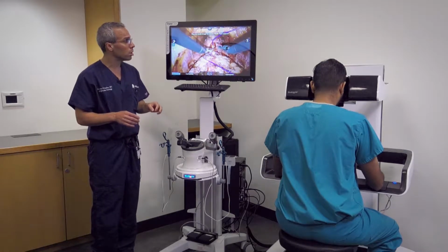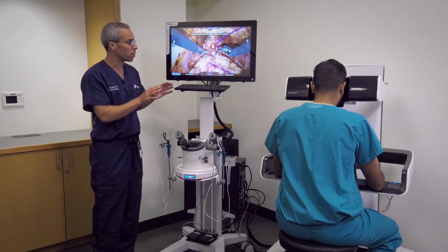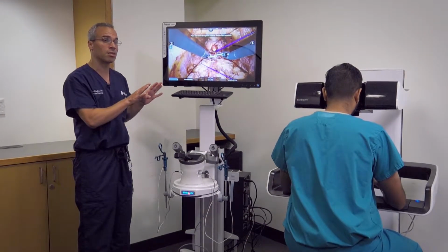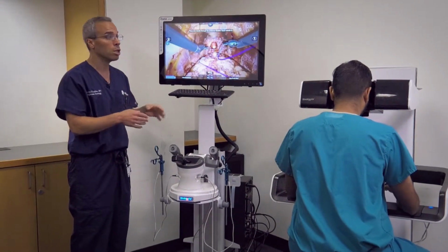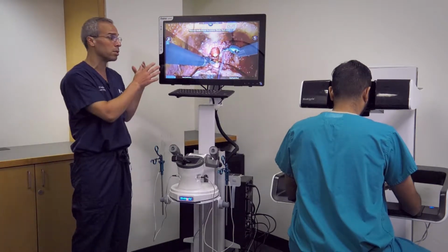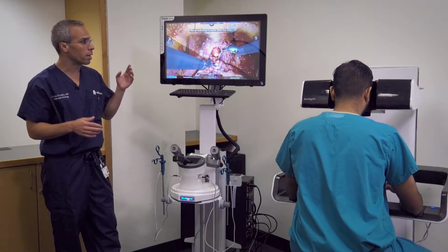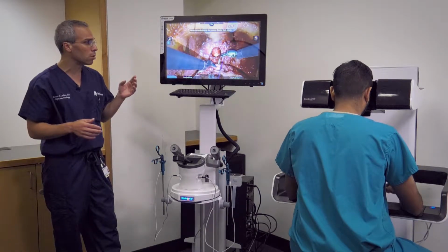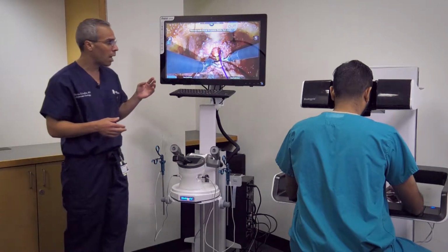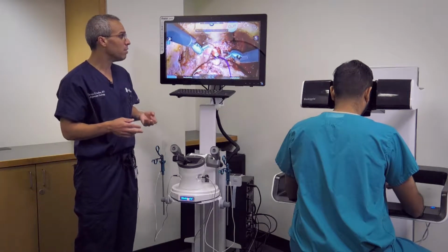And this is something that I would be teaching him in the operating room, right? This actual part of the operation. But again, the nice thing about simulation is that he can come, look at this, get used to it before he actually goes into the operating room, so practicing on a simulator versus practicing on a patient. And again, one thing that I was sold on when I saw this software the first time was the realism, how the tissue behaves, the anatomy, even the suture.